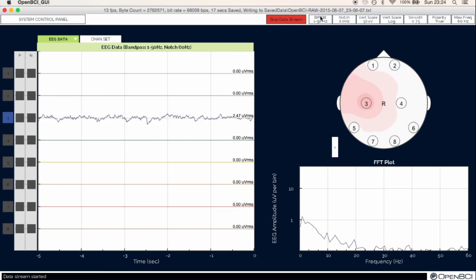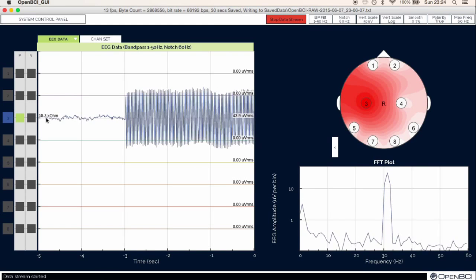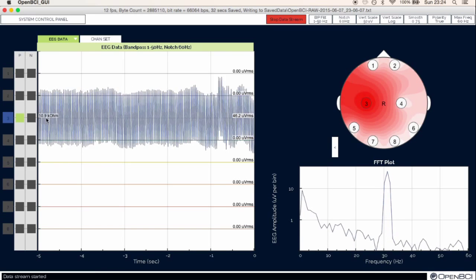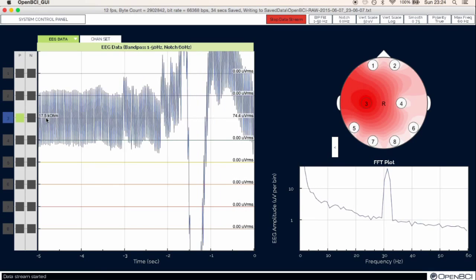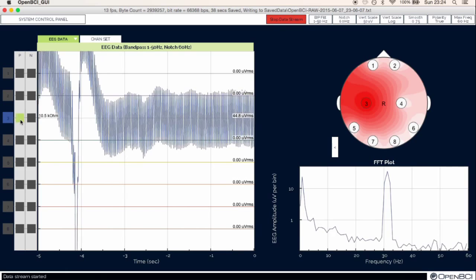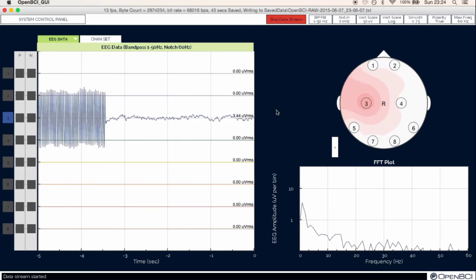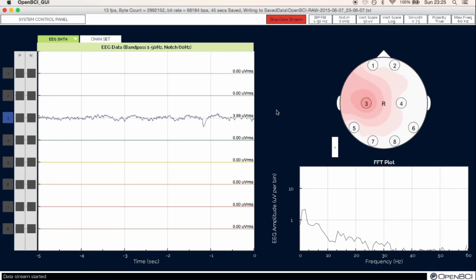Also notice that we have a lot of high frequency noise, so we'll add a bandpass filter to filter out some of it to make the signal a bit smoother. Now a good signal should have a fairly low impedance, and we've managed to attain an impedance of roughly 10 kiloohms, which is actually quite respectable. Down on the bottom right, you'll also notice that there's an FFT plot, which shows frequency on the x-axis against the amplitude. And this is really what the software team will be dealing with when doing their analysis.